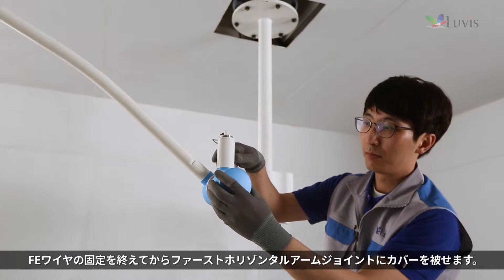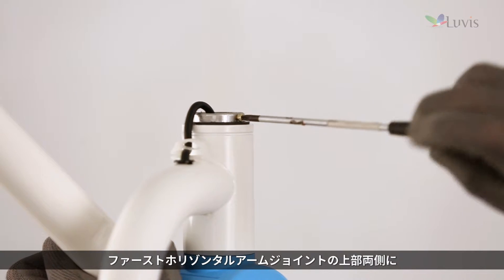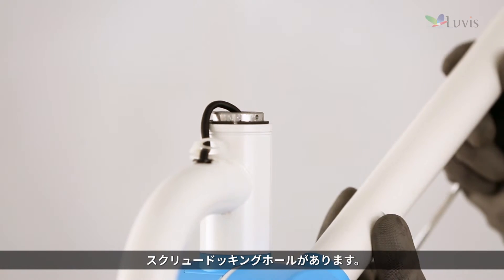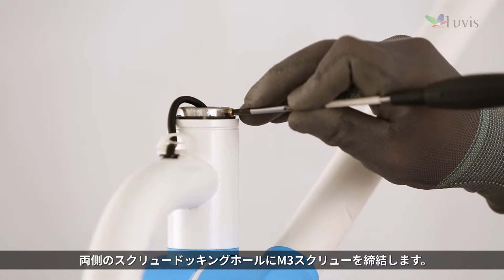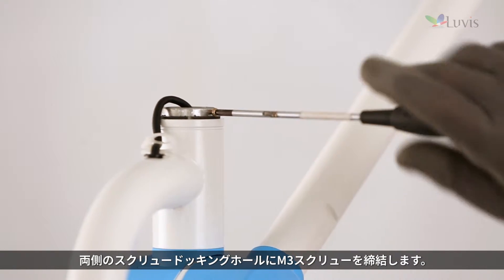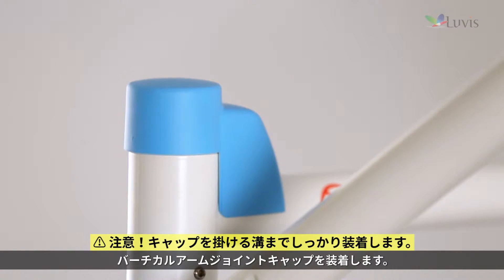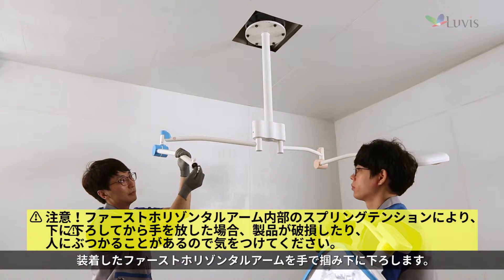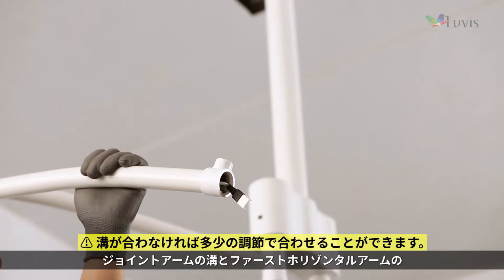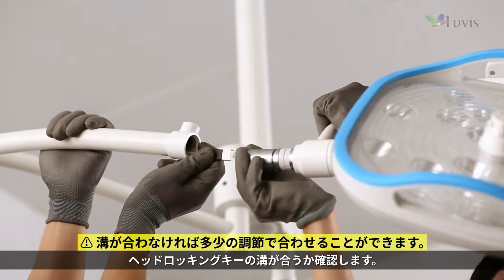After fixing the FE wire, put on the first horizontal arm joint cover. There are screw docking holes on each side of the first horizontal arm joint top. Tighten the M3 screw to the screw docking holes on both sides, then install the vertical arm joint cap.